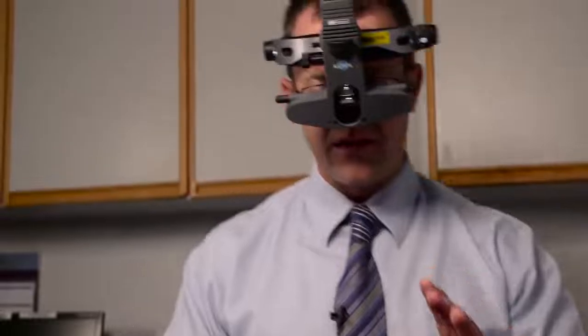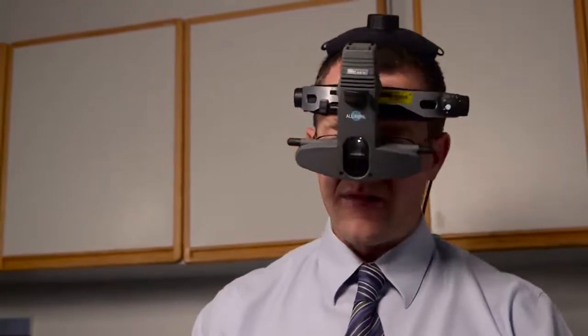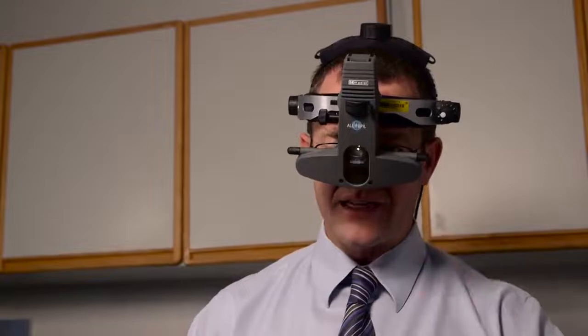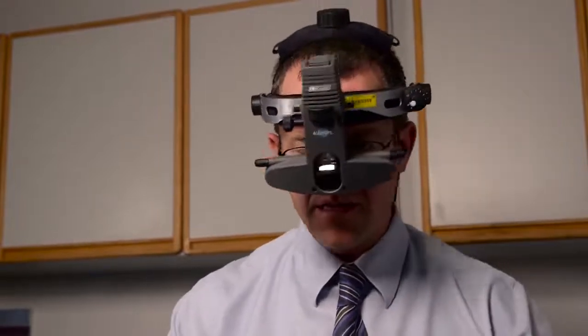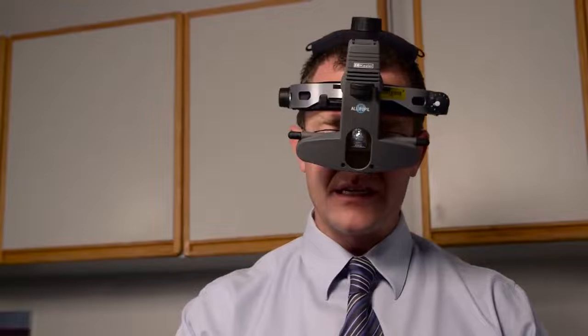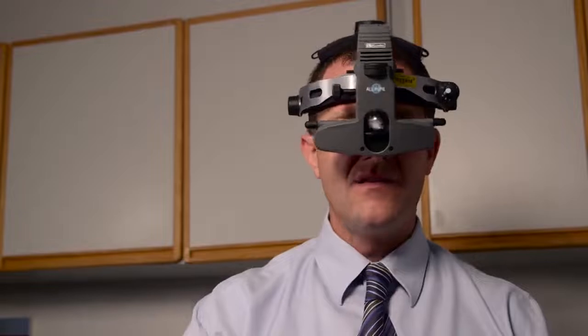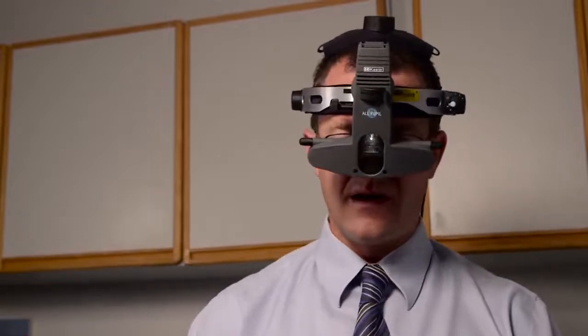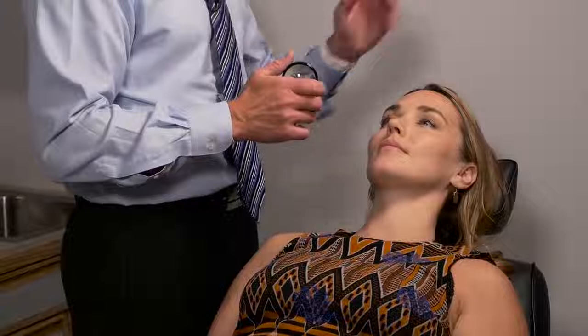Sometimes, let me tell you another key thing. Sometimes there may be a language barrier. We have a lot of patients that speak other languages here in the Salt Lake Valley. We also have a very large Hispanic population, so learning Spanish is a very nice thing. And sometimes if there's a little bit of a language barrier, if you just gently tap, you don't have to say you're tapping. You just tap. Especially patients that can't hear also, you just tap lightly in the location you want them to look. They will naturally look there. It works very well. And if you have a patient you feel like you're just not communicating with, or they don't want to hear you, just tap before you focus, and they'll just naturally look in that location.